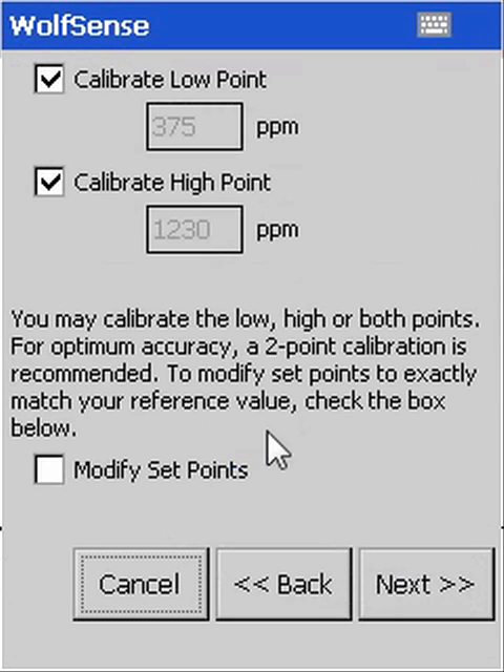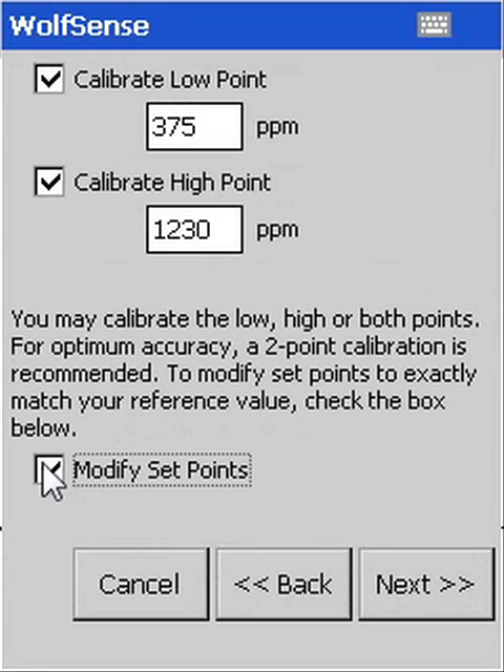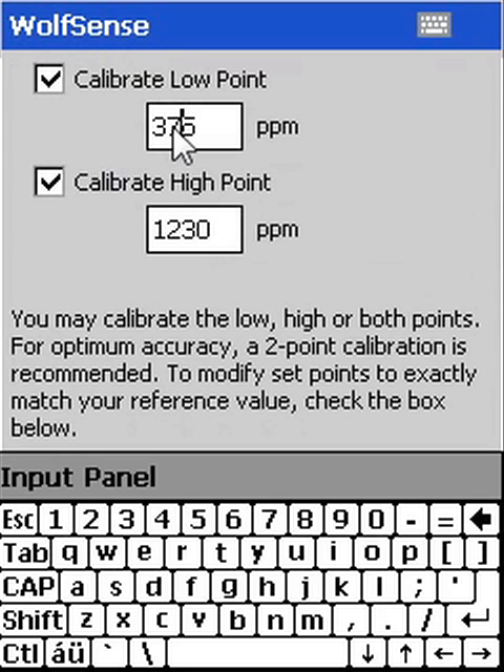Be sure to match the calibration points to the actual value of your reference gas, or, for added caution, to the high end of the calibration gas uncertainty range.